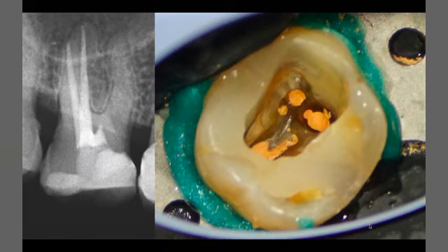Because of the calcified mesial root, the previous dentist couldn't negotiate the root canal. He drilled in another pathway, so he stopped. And this is a very good thing: to stop when you can't find the root canal. Don't drill more, otherwise you will perforate the tooth. So he stopped, and then he did the final restoration.